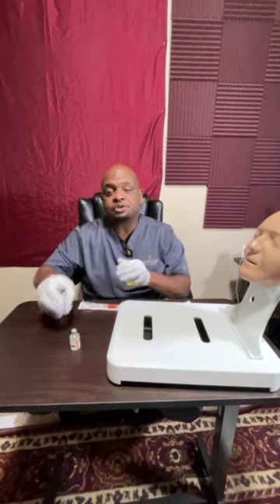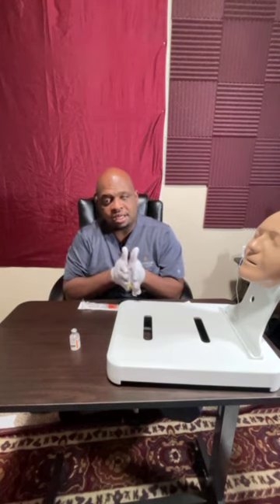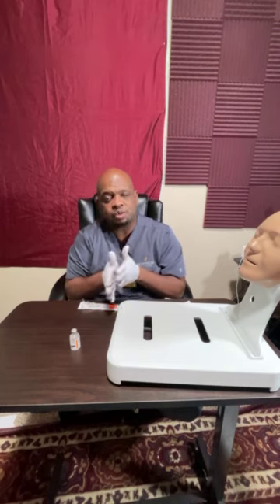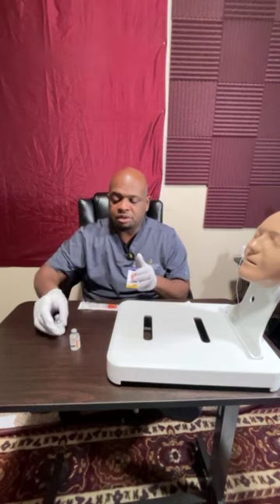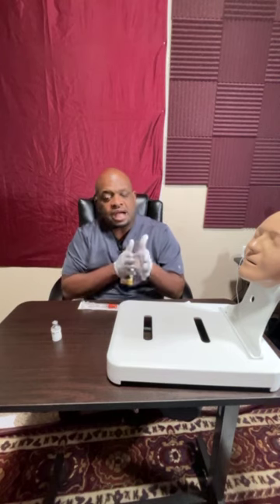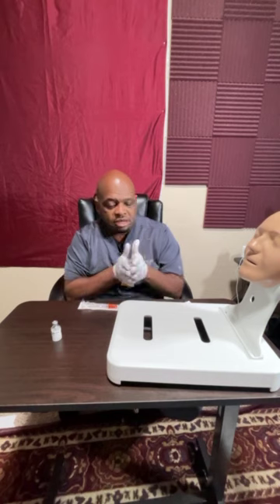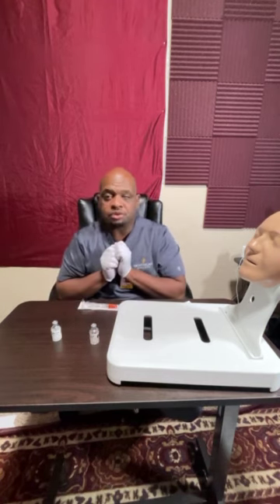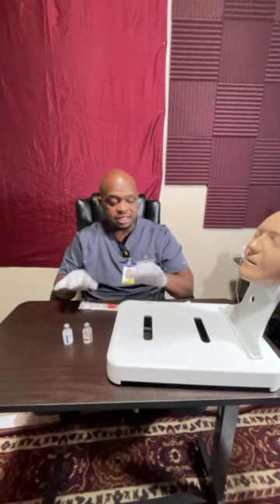Before I even put the first alcohol wipe on, I'm going to first prep the insulin by rolling it in my hands as I'm mixing it slowly. Not too rough. Don't want to shake it. Don't want to get any type of bubbles in there. So that was for the NPH, and then also for the regular, same thing. I verified when these came out of the refrigerator, because we're going to be giving these at room temperature, that these are not expired medications. I checked the date for both of those. So these are good to go. Not expired. They're still in good standing.